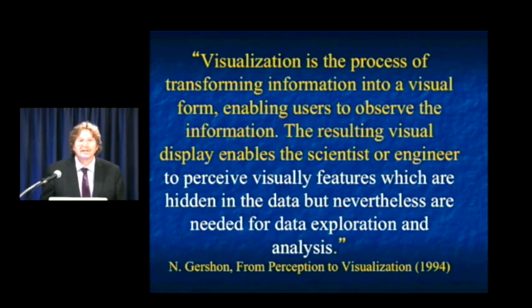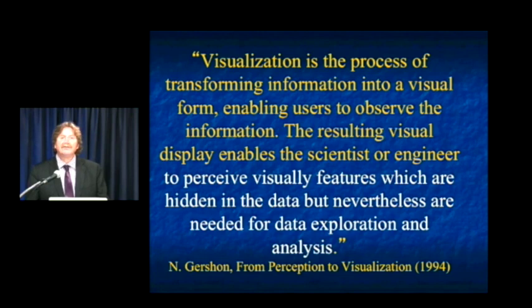Visualization is the process of transforming information into a visual form, enabling users to observe the information. The resulting visual display enables a scientist, engineer, or radiologist to perceive visually features which are hidden in the data but nevertheless are needed for data exploration and analysis. That is indeed very important.